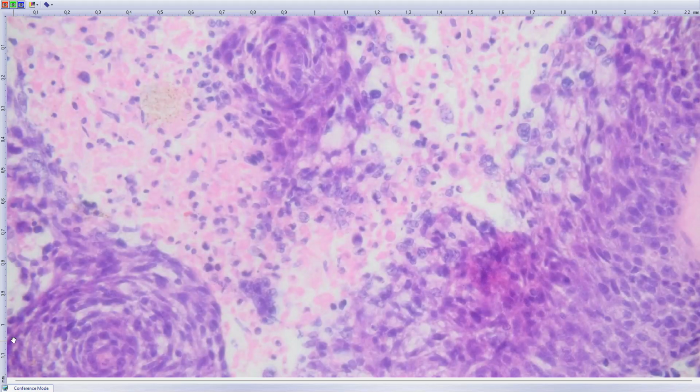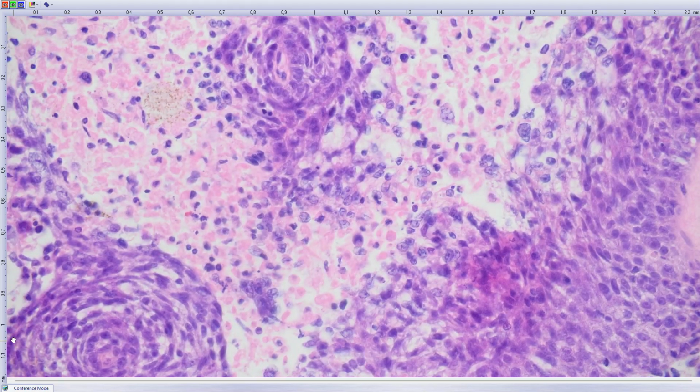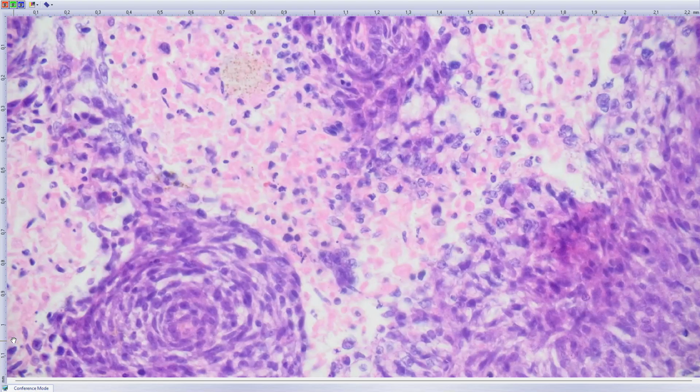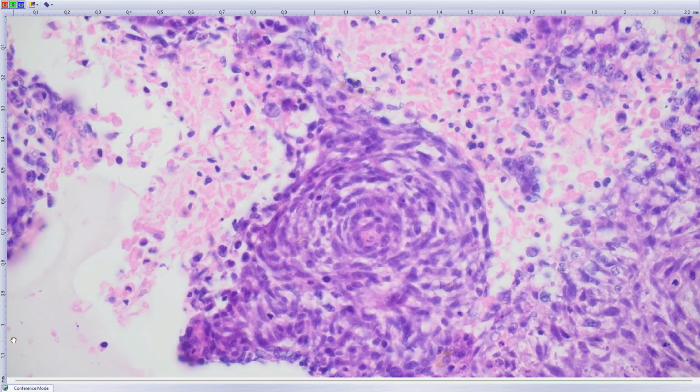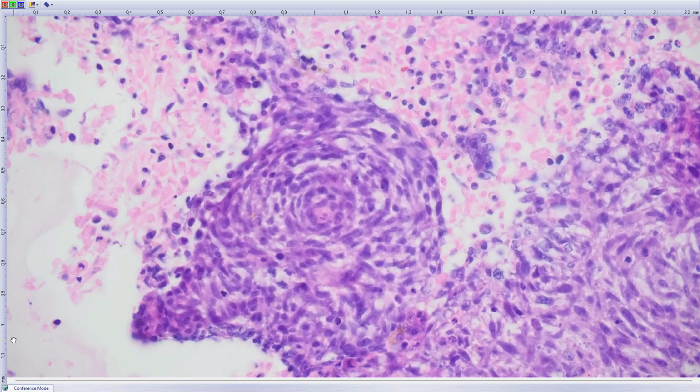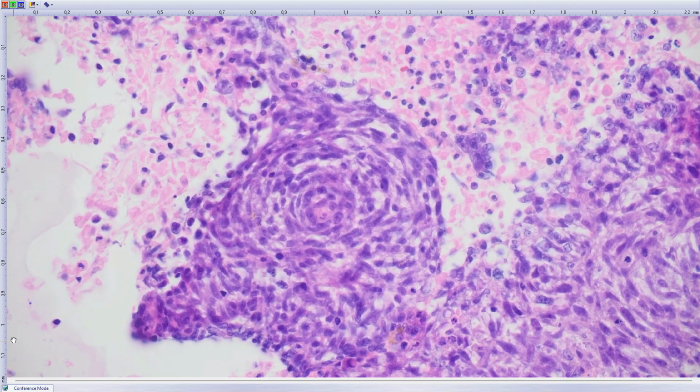So I repeated melanoma markers and added some because they had only, I believe, 2 or 3. There is also some necrosis there. So after we ruled out melanoma and glioma, because GFAP was focally positive, but GFAP may have cross-reactivity with epithelial lesions.